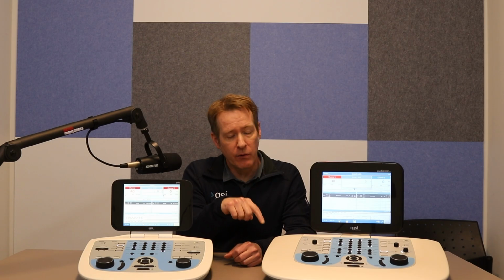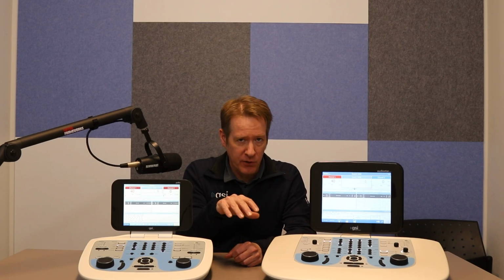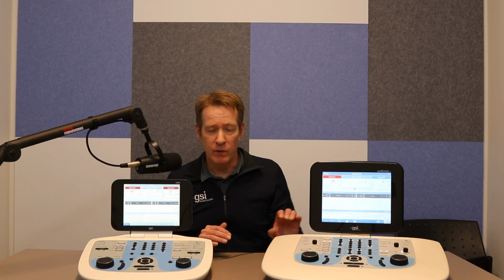And then when we hit interrupt, it's going to play the first word, it's going to mark it correct, and then move on to the next word. Now that just allows us to kind of get freed up with our hands. We can do notes and things like that, and maybe keep one hand close to the incorrect button. So when they make a mistake, then we just override the automatic correct, just hit incorrect before the end of that next word being presented, and it will change the result for us.